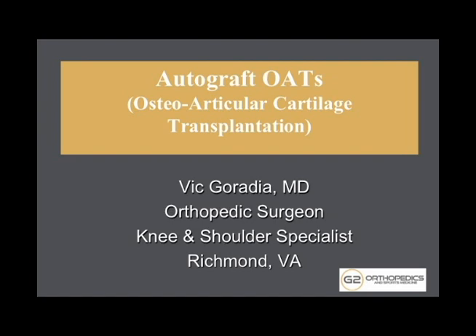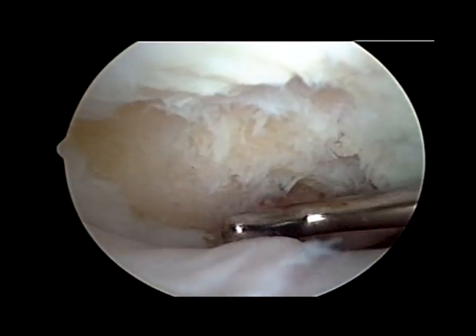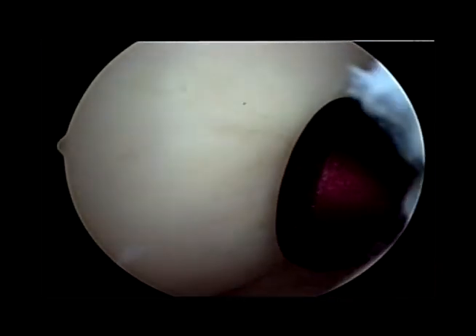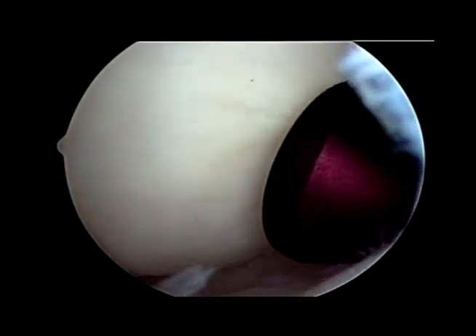This is a video description of an OATS procedure in which cartilage is taken from one area of the knee to fill a defect in another area. Here we see cartilage worn down to bone. We're going to take some cartilage and bone from another area of the knee that's non-weight bearing.